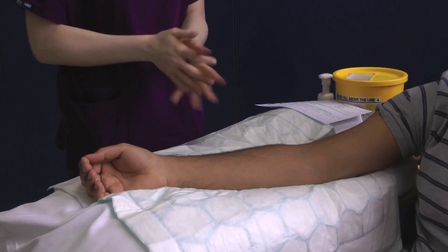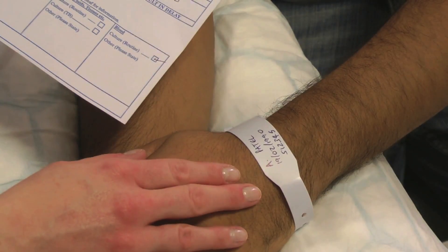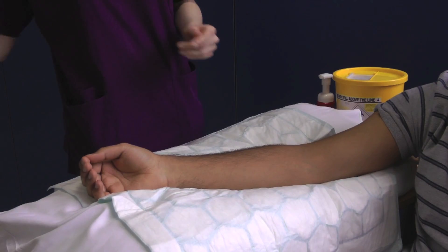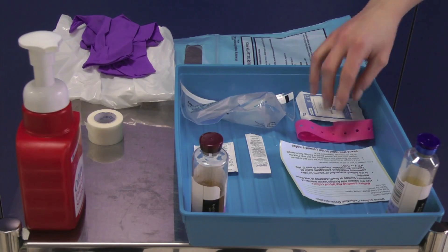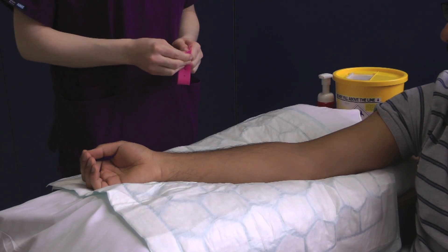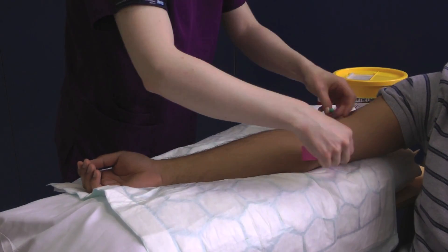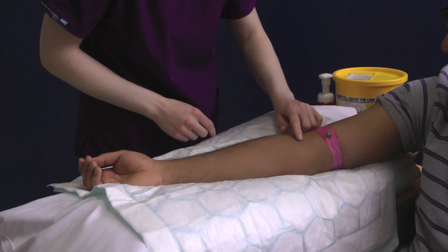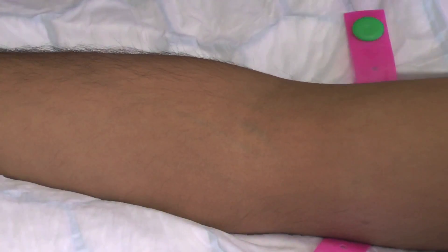At the patient's bedside, decontaminate your hands and reconfirm the patient's identity against the blood culture request form. Make sure that the patient is happy for you to proceed and position them so that they are comfortable, ensuring your equipment and sharps bin are within easy reach. Apply a disposable tourniquet to the patient's arm and palpate for a suitable vein. Once you have located the vein, release the tourniquet.